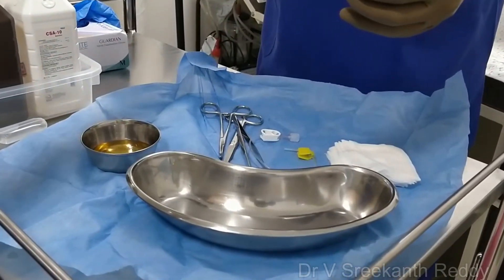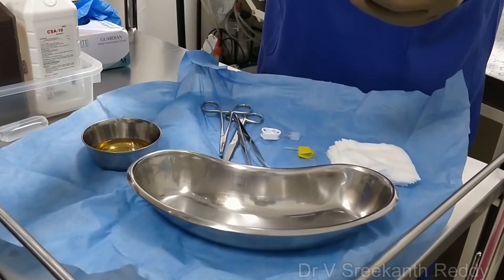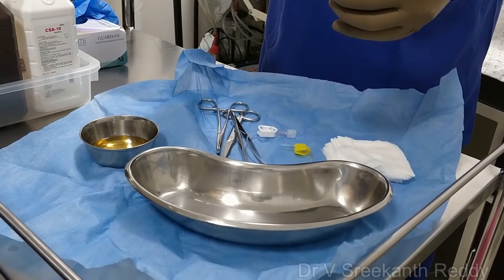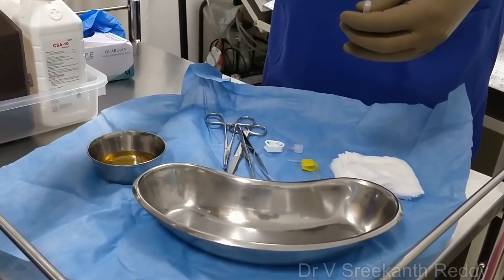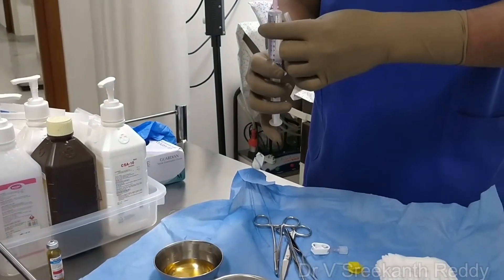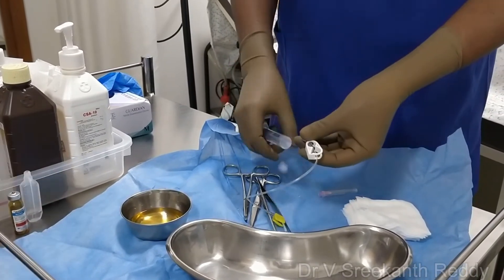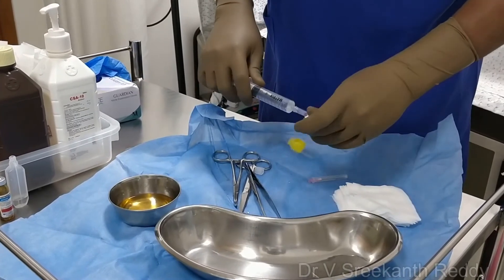With the 10cc syringe, load the heparinized solution if it is indicated for the procedure. Then dilute the heparinized solution with 10ml of normal saline. Don't forget to flush the Huber needle before you do the insertion and then lock it.